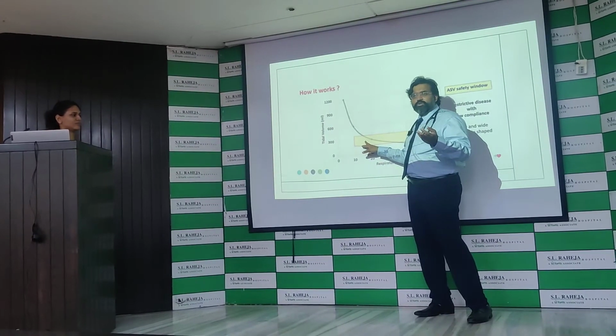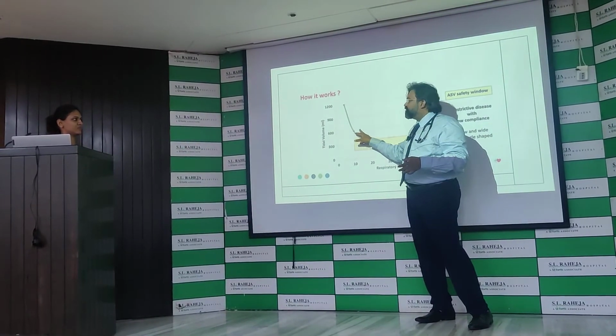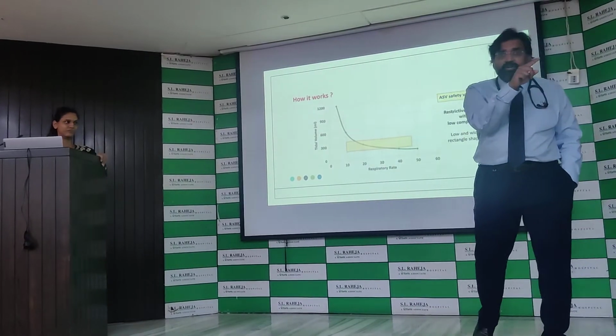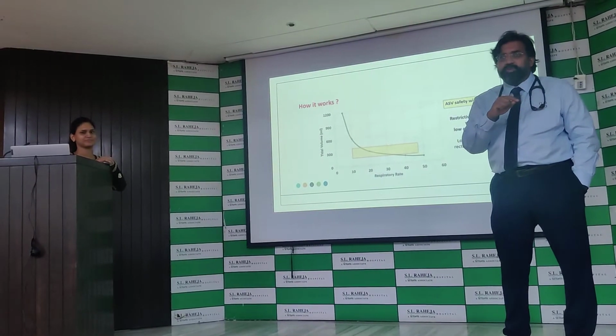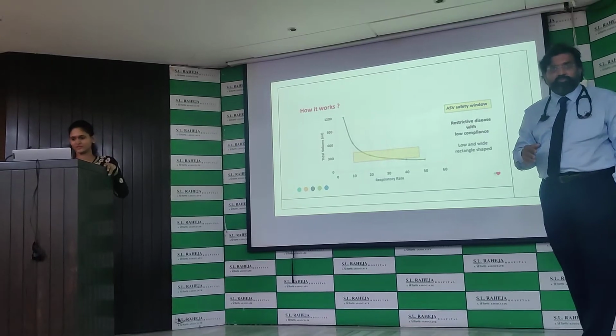Essentially it's pressure control. So what is going to happen is it will change the pressures in such a way that you are no longer subjecting this patient to such a high tidal volume. So at any given moment, if you switch on the ventilator that is working there and you press tidal volume, you will not see it going more than 6 ml per kilogram. You have to do everything possible to keep it less than 6 ml per kilogram. You understand?